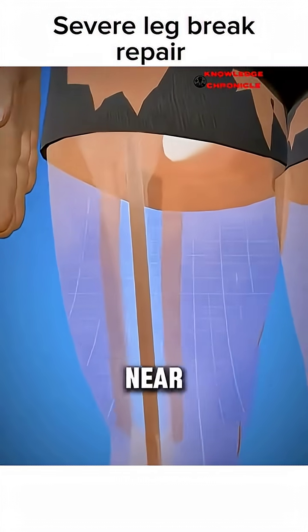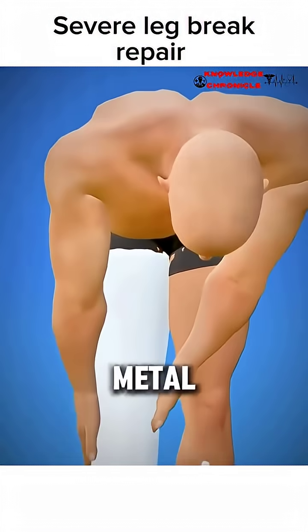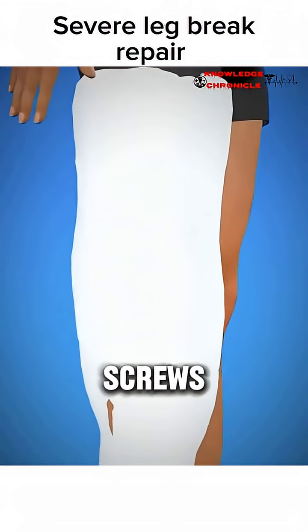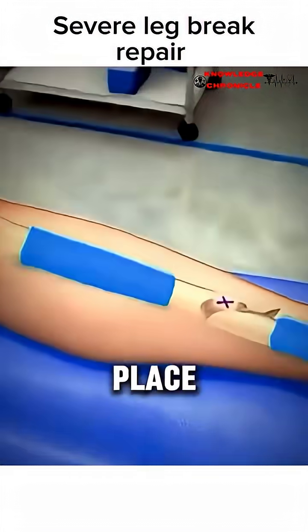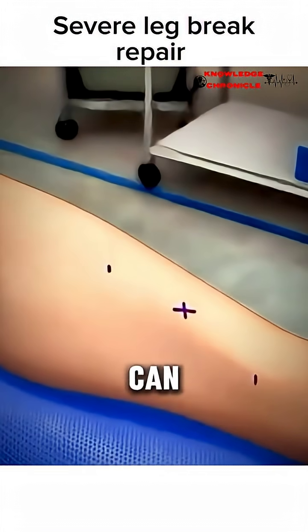First, the surgeon makes a small cut near the fracture and carefully lines up the broken pieces of bone. Then, metal plates, rods, or screws are placed directly onto or inside the bone to hold it firmly in place. This gives the bone stability so it can heal straight and strong.